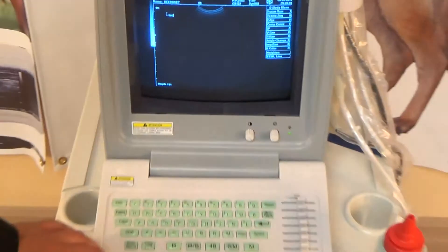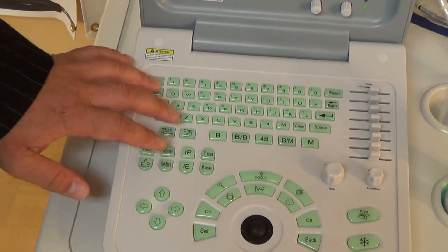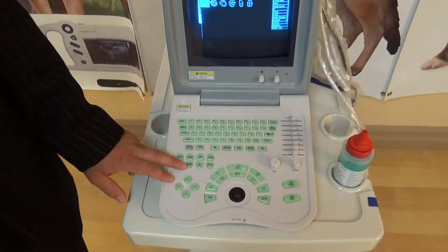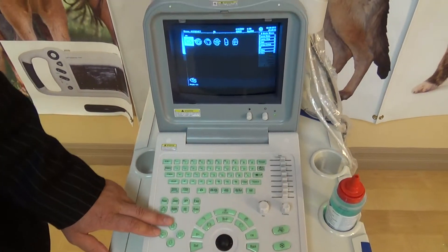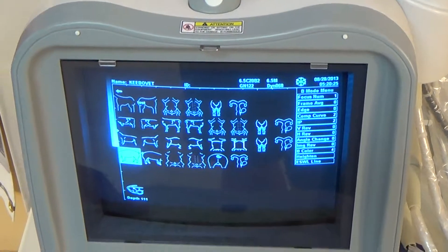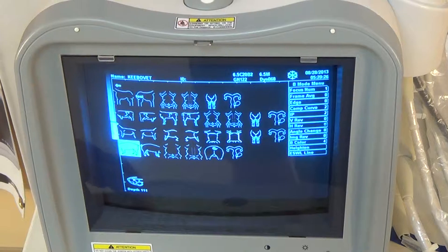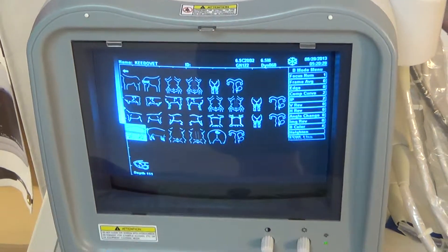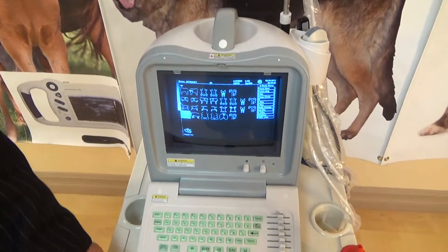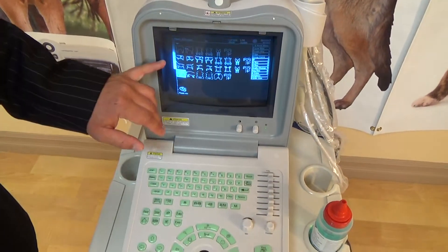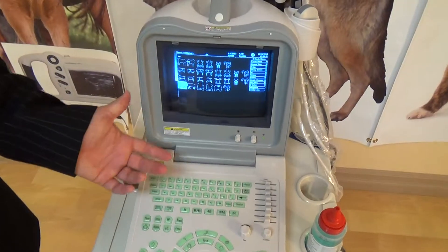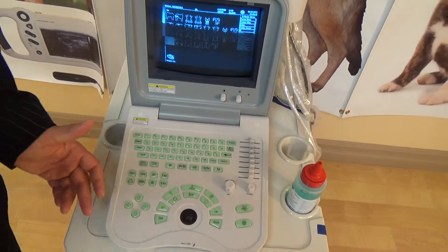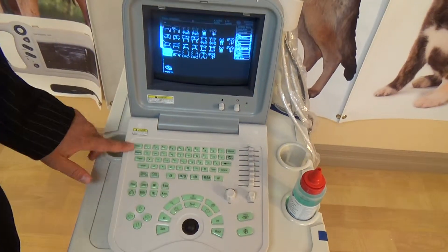The next button right underneath that is the Body Marker. If you're doing an exam on horses, animals, or hearts, you can clearly see there are all different types of functions. This is not really used by everybody, but some people like to have image markers depending on what they're imaging — it's more of a user preference, but it is available.